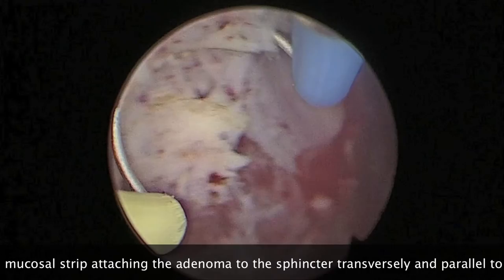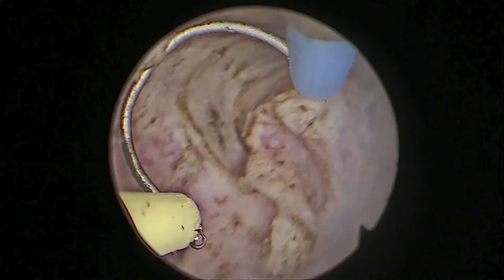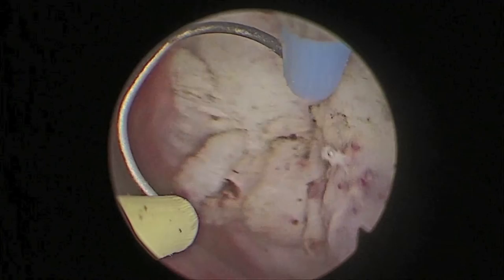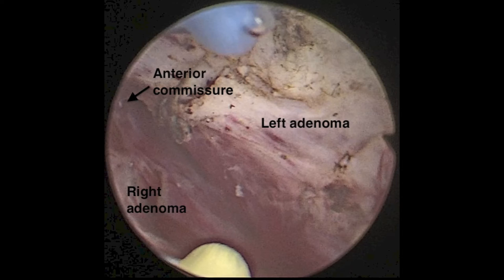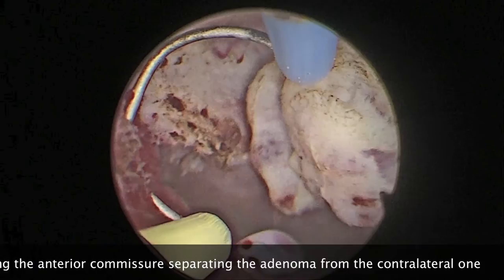On the other side, the mucosal strip is similarly identified by looking at the verumontanum and the adenoma, and then the mucosal strip is cut in a similar way. The mucosal strip is cut transversely and parallel to the sphincter fibers. Similarly, cutting proceeds at the anterior commissure, separating the adenoma from the contralateral one.